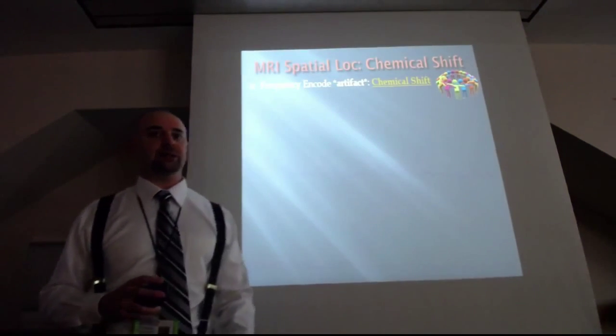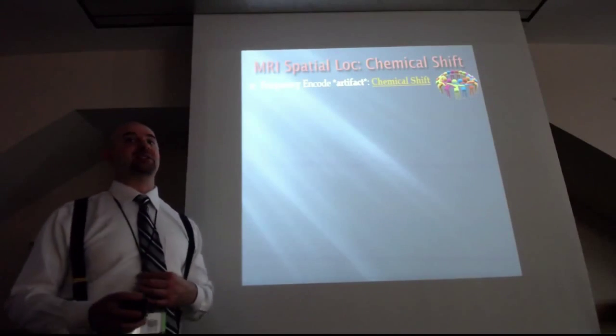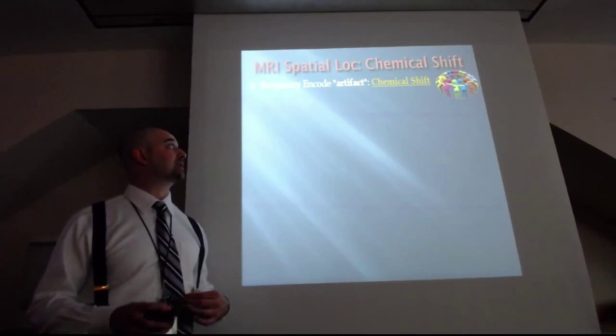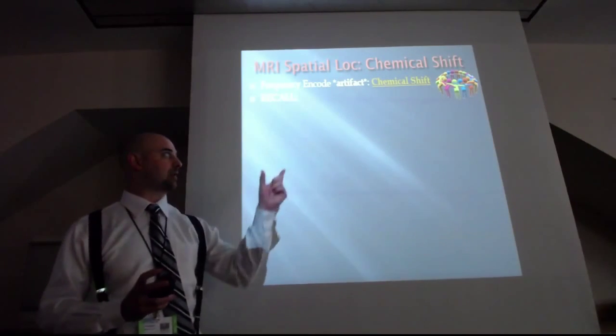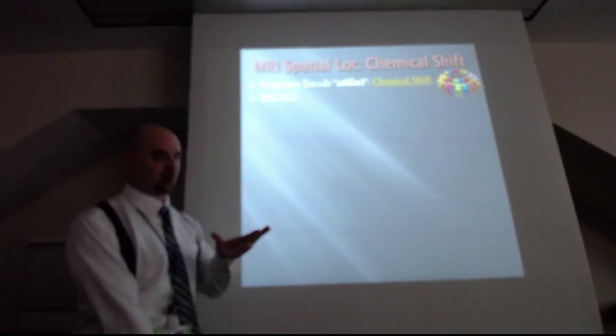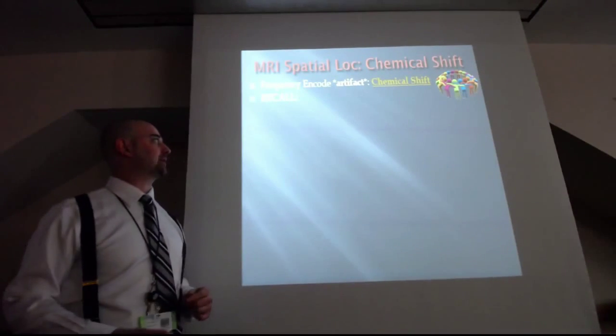Okay. Chemical shift artifact. So this is a big one. They like to talk about this on the test and ask you a lot of questions about it. So this is a frequency encoding artifact. And I'm going to ask you, this is the huddle up symbol, because I'm going to go through a long bunch of steps, one after the other, and it'll pull together in the end.